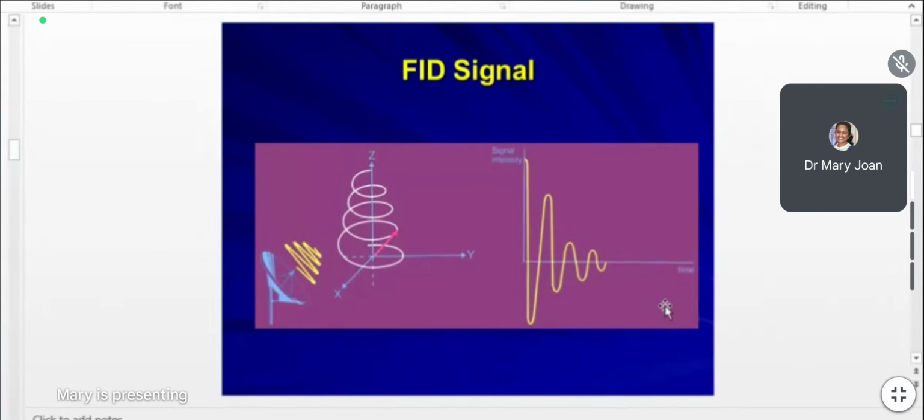No. What I am telling is, acquiring is a different thing. But what is happening is T1, T2, proton density, all this is happening. You are understanding what we are talking about is the acquisition. No, acquisition is a different thing.